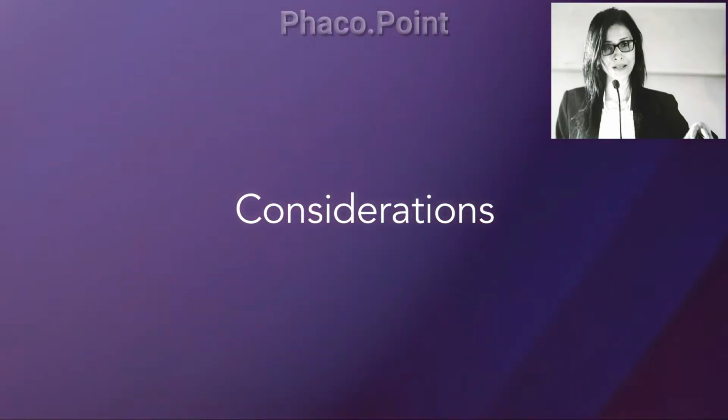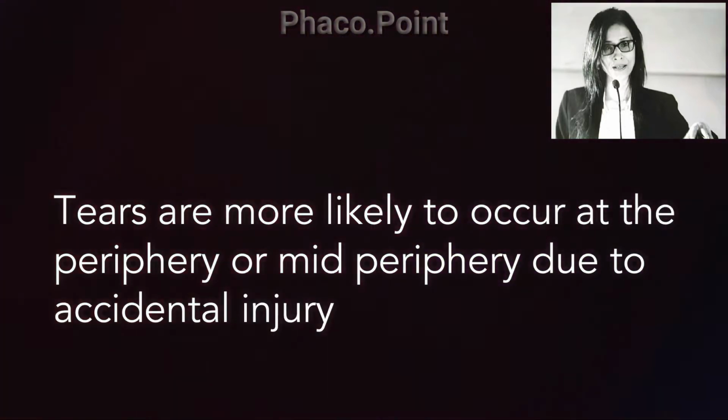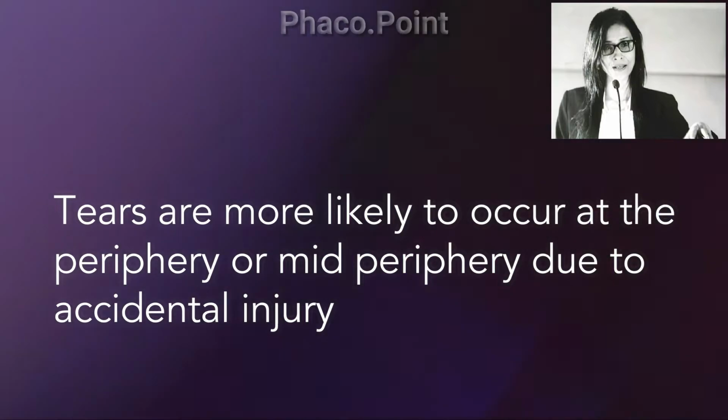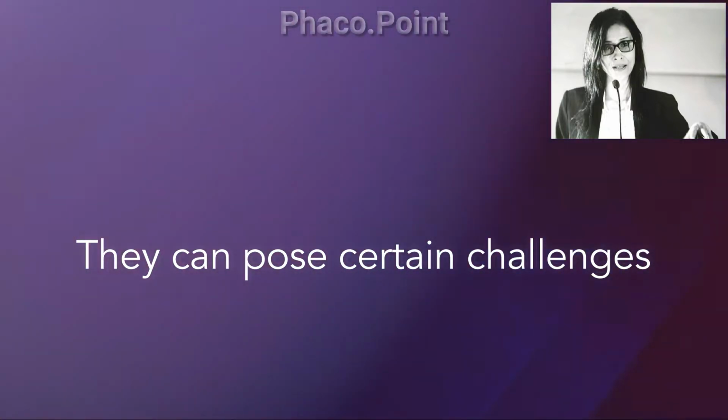1. Tears caused in the anterior capsule due to accidental injury by the keratome are more likely to occur in the periphery or the mid-periphery of the anterior capsule. Now these can pose certain challenges.